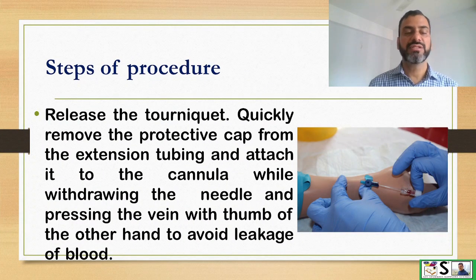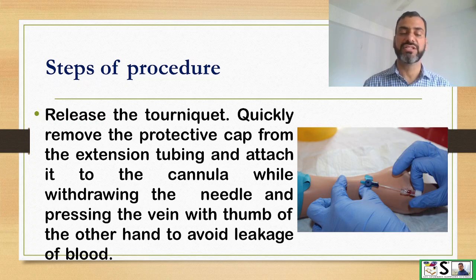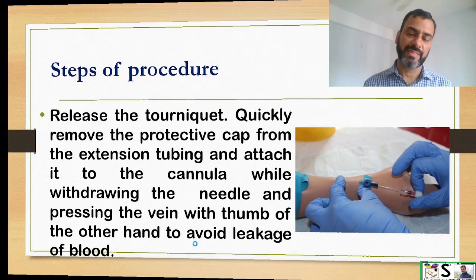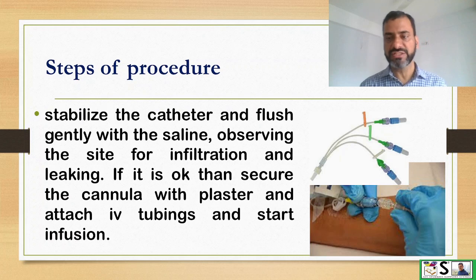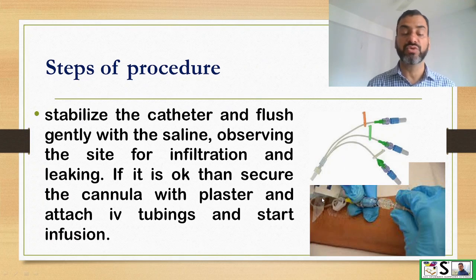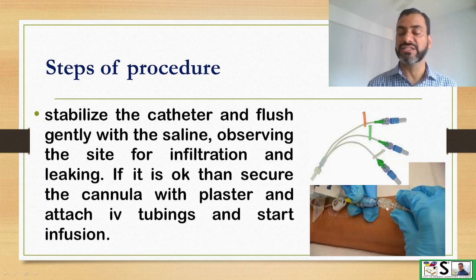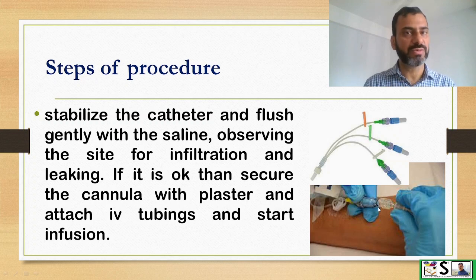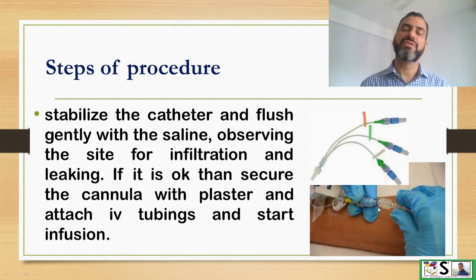Now release the tourniquet. Quickly remove the protective cap from the extension tubing and attach it to the cannula while withdrawing the needle, pressing the vein with the thumb of the other hand to avoid leakage of blood. Once the extension tubing is attached to the cannula and the IV drip set is also connected, flush with normal saline using a syringe and check for infiltration or leakage. If it is fine, attach the IV drip set and start the infusion.